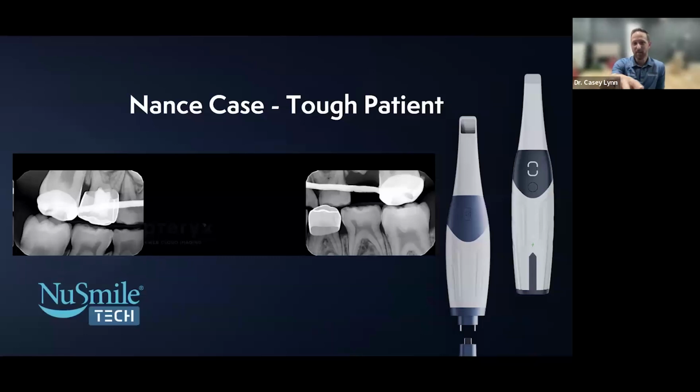This is another example of what those SLS or 3D printed ones look like, cemented on the teeth. It gives you the idea of where the contour is, and you can see it's not dropping distal where that operculum would typically sit. So we did this for this kid, another sensory heavy kid who didn't like a lot of stimulation.